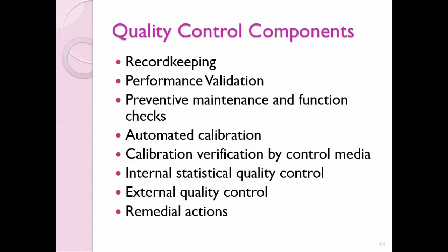You know, if a case goes to court and you provide values to the jury, well, first thing they're going to ask is, how do we know these are accurate? And then you're going to have to produce all the quality control stuff that says, yeah, the machine was performing to its capability.